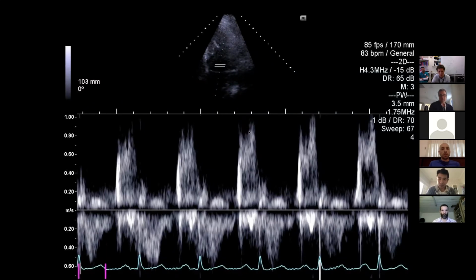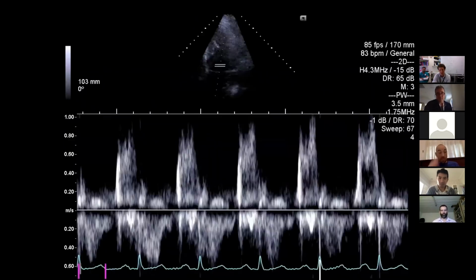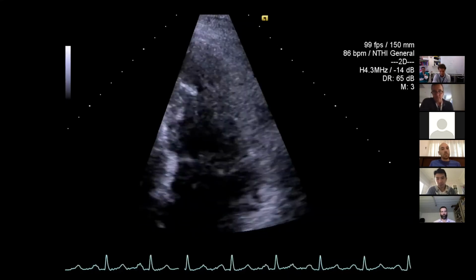This is a pretty dodgy mitral valve inflow view, so I apologise, but I'm trying to demonstrate, to make you think about the E prime and the E wave, and if that E wave is greater than 1.3, it points towards severe. It's not an absolute. It's not perfect. It's not absolutely guaranteed, because I'm going to go on to show this is severe regurgitation, but here we can see that we don't have an E value that's greater than 1.3. So it's not perfect, and another example of how sometimes not all the parameters fit, and sometimes those patients aren't reading the textbook.